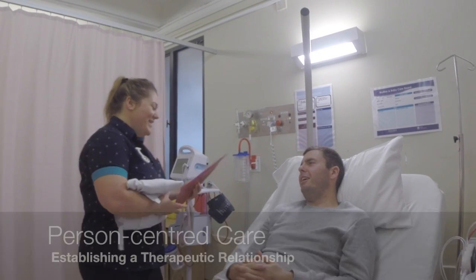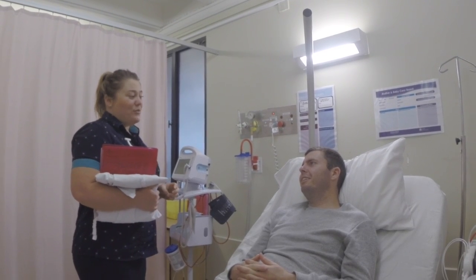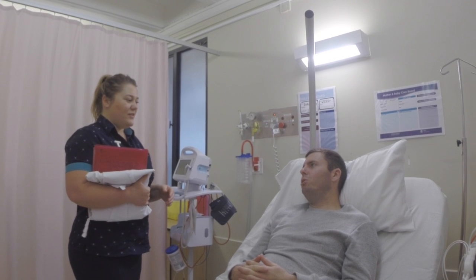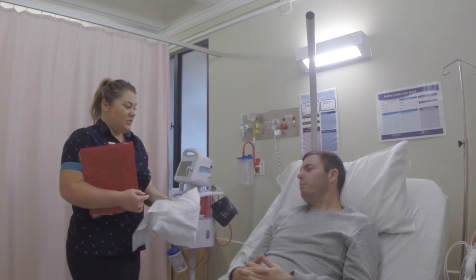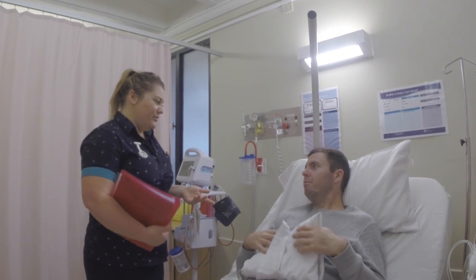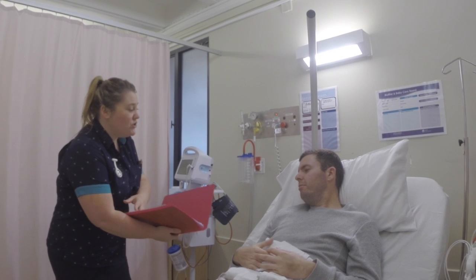This clip shows Ashley introducing herself and explaining the indications for the ECG. She asks questions such as, 'Do you know what an ECG is?' and then goes on to answer any other patient queries. The patient was concerned he would be electrocuted, and Ashley provides education in relation to this particular myth. Increasing their awareness and confidence empowers the patient to make informed decisions about their own healthcare and incorporates them in the treatment plan.